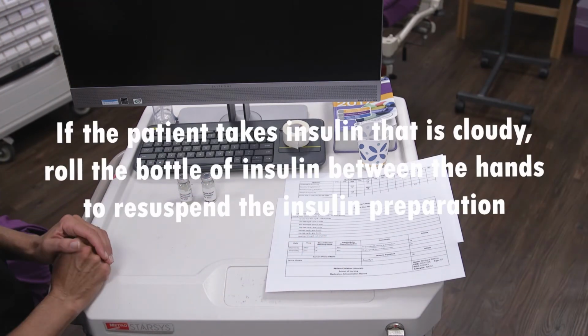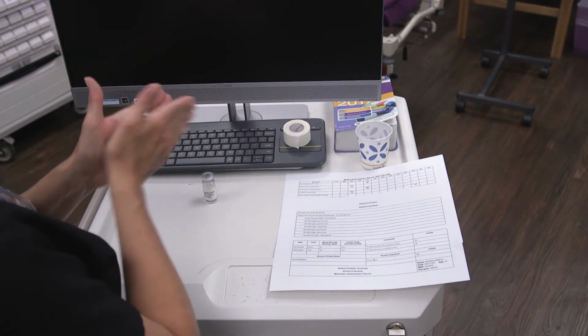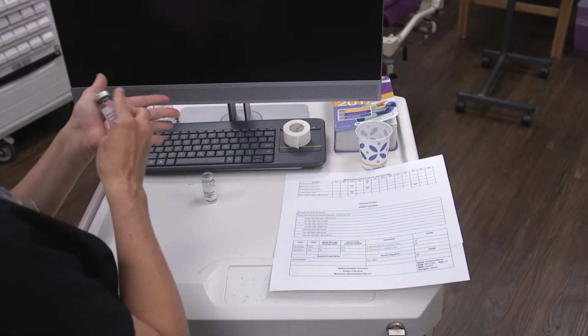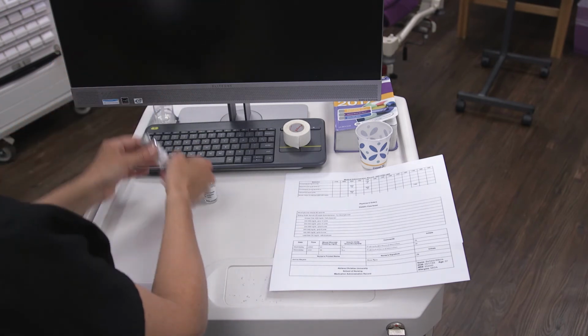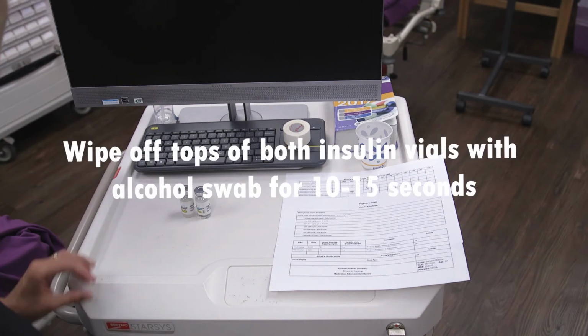If the patient takes insulin that is cloudy, roll the bottle of insulin between the hands to resuspend the insulin preparation. Wipe off tops of both insulin vials with alcohol swab for 10 to 15 seconds.